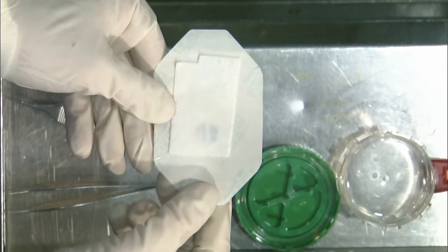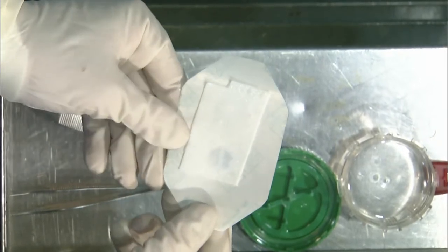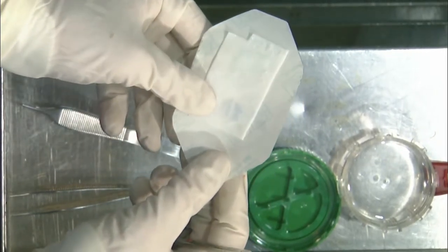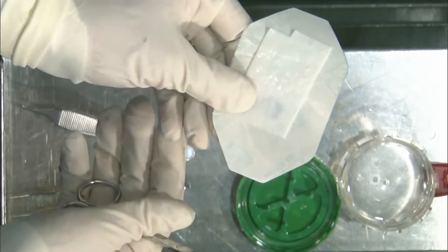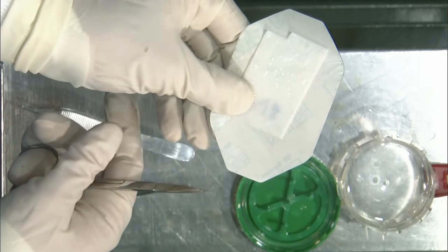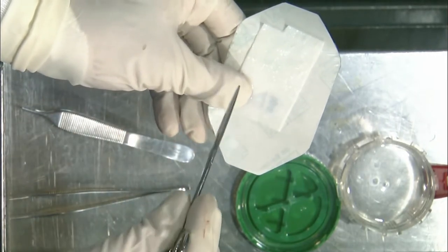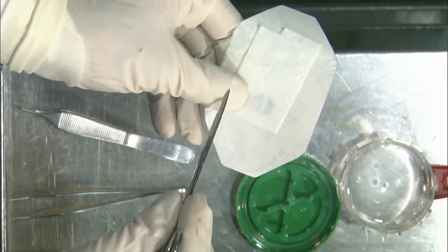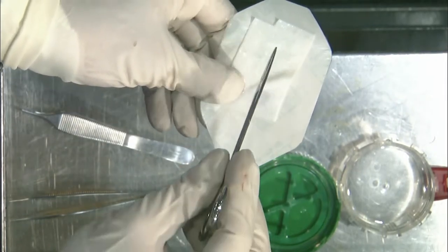So that means not putting a lot of thumb pressure over the top of it, not necessarily holding it in place. Basically what I'll do, and again, everyone probably does it a little bit differently, is put my thumb right next to that implant, but not on that implant, understanding that I'm damaging some of the cells in this area, but I'm not necessarily going to need them. If I do need them, I have the rest of the cells in this area.